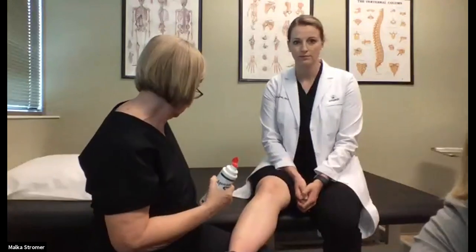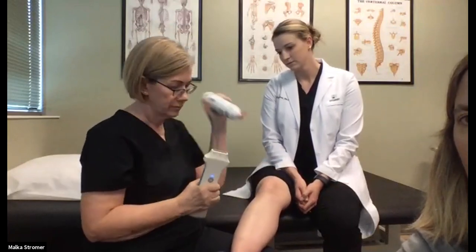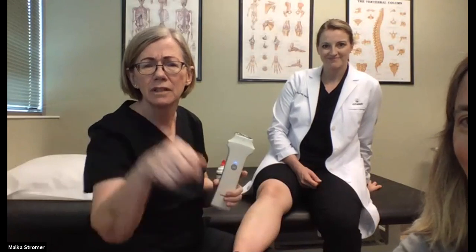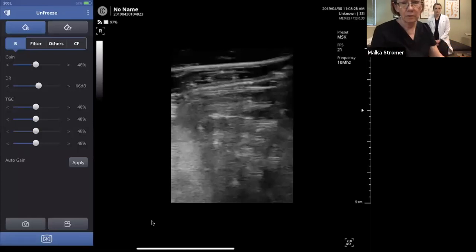We're going to switch over to the ultrasound now — we're using our handy Hillerion. We have a brief technical difficulty here. There we go — perfect.